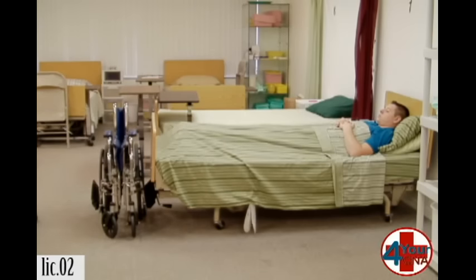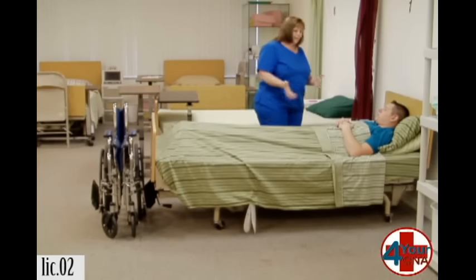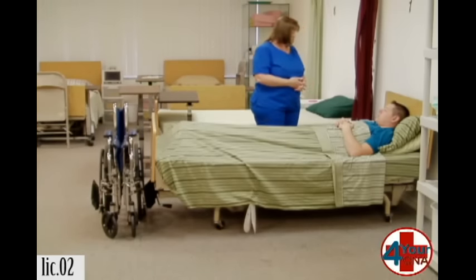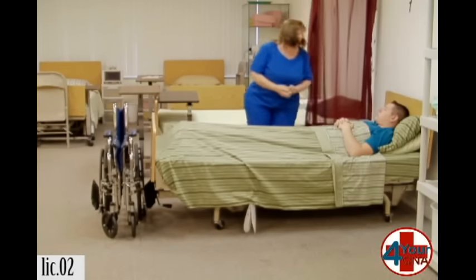Hi, Mr. Jones. My name is Patty. I'm your CNA today. How are you? I'm okay. How are you? Good. I need to get you out of bed and into a wheelchair. Is that okay? Yes. I'm going to pull your curtain for privacy. Let me go wash my hands, get my supplies, and I'll be right back. Okay.